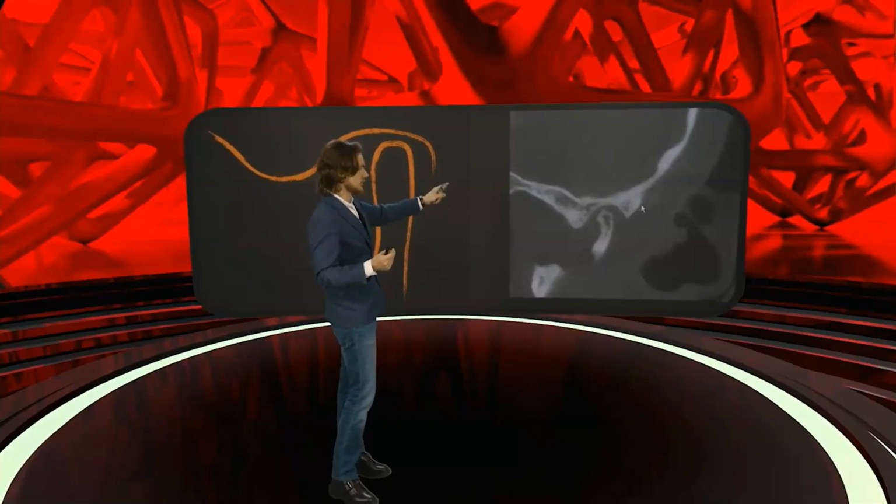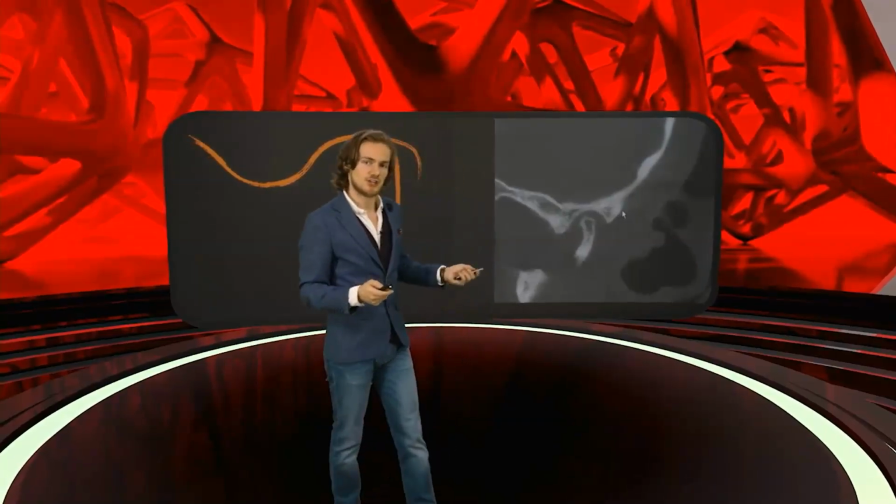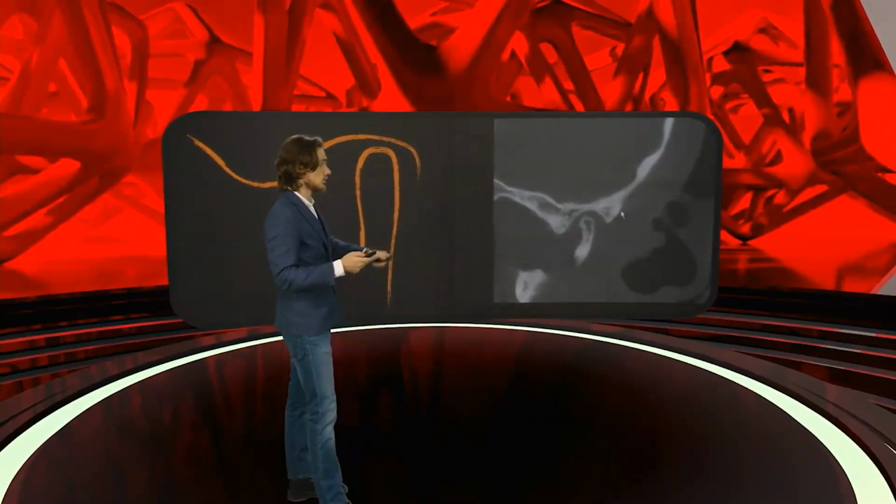The eminence is fine, the cortical bone is fine, but this condyle is just very little. And the smaller the condyle, the bigger chance that there is going to be some disc internal derangement, because the distribution of forces on a small condyle is much worse than on a big condyle, right? This is why a small condyle is a risk factor for disc displacement in the future.